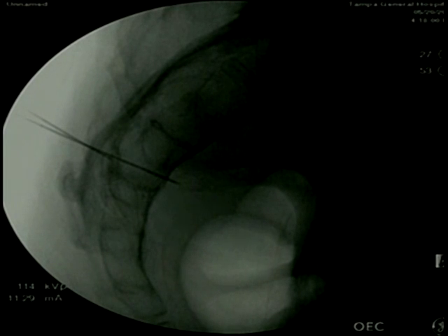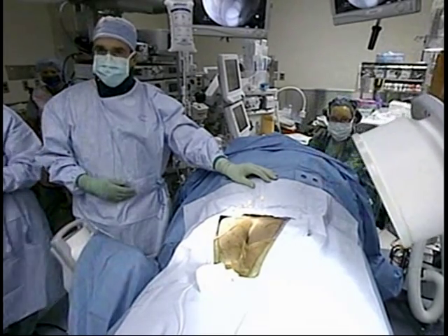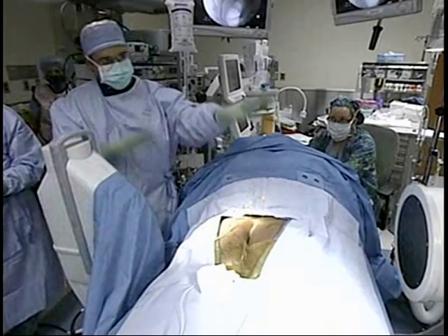He's using fluoroscopy here, trying to find the exact spot. Sometimes it can be difficult depending on whether the patient has any type of scar tissue over time, which can make it hard to get into the actual foramen. He's now happy with the medial-lateral position and is going back to the lateral view.